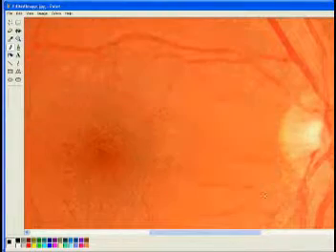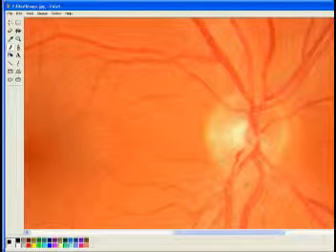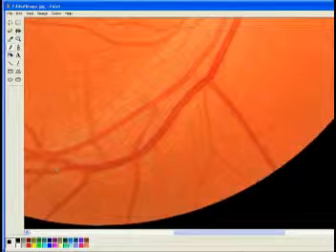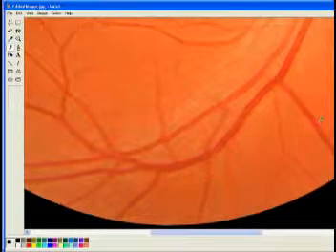As we scroll down here, you can see the optic nerve, largest nerve in your body, nice and healthy, no signs of glaucoma. By looking at your blood vessels where they cross, we can see indications of whether or not you might have hardened arteries. You don't show me. There's also no evidence of diabetes.